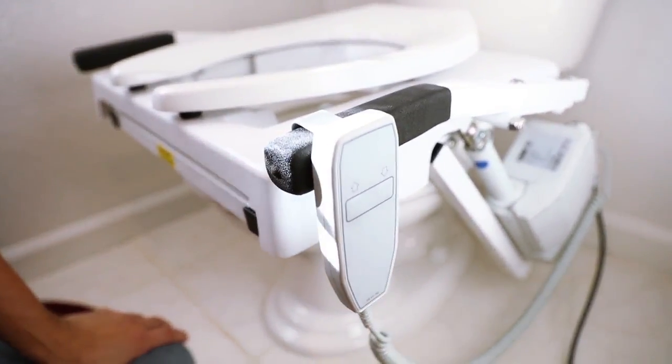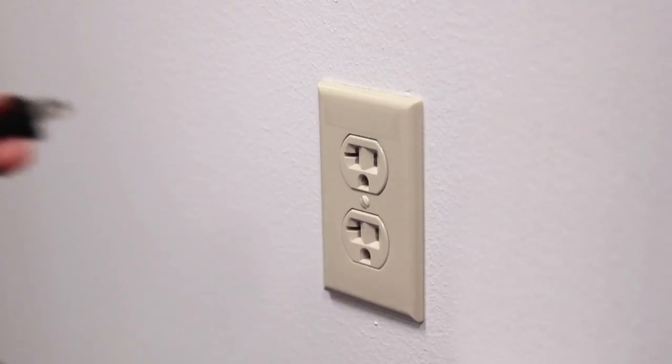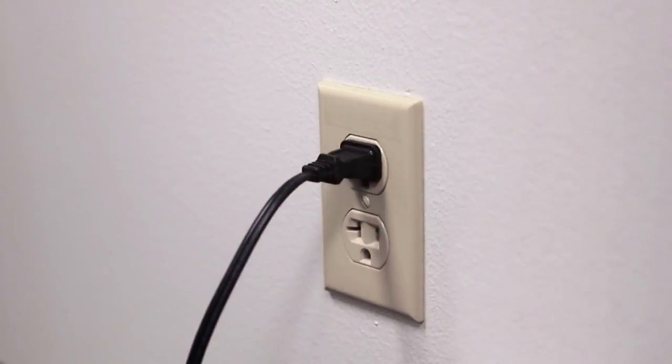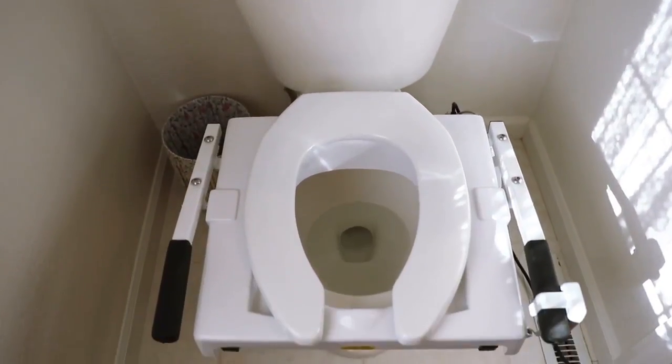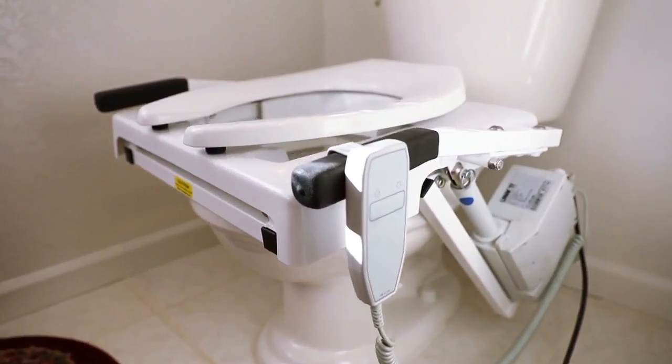Simply hook the push button control on the arm and plug the unit into a standard wall outlet nearby. Congratulations! You have successfully completed your tilt toilet incline lift installation.